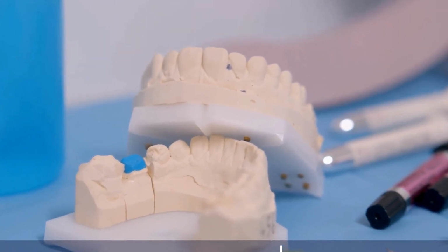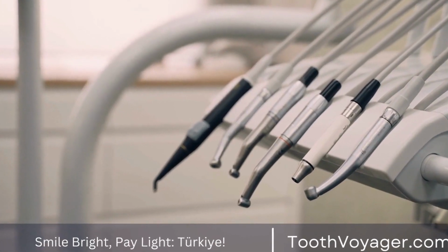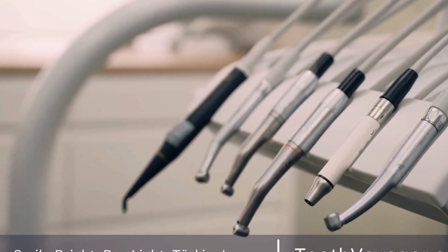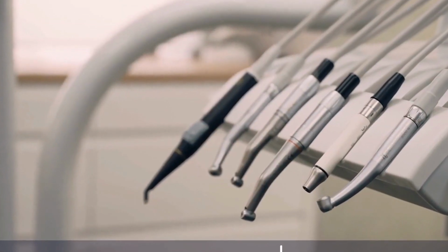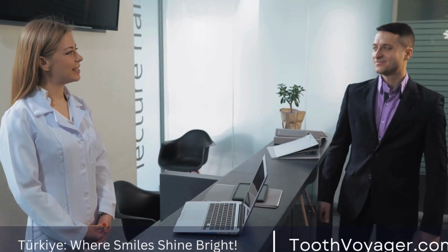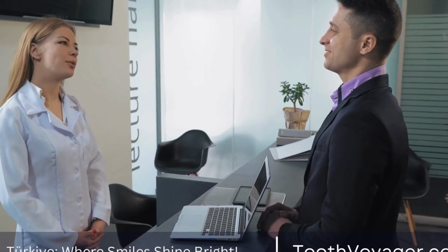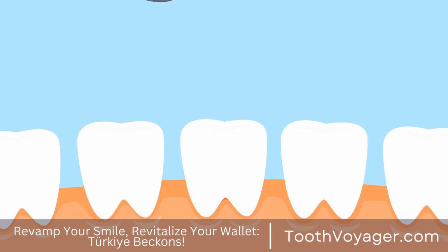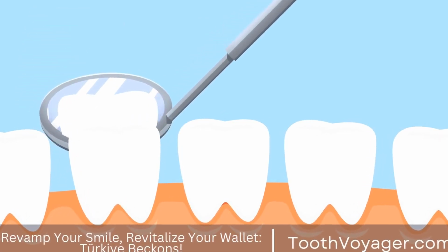During this time, the patient will need to follow post-operative care instructions to ensure proper healing and integration of the graft. After the bone graft has fully healed and integrated with the surrounding bone tissue, the patient may be ready to undergo the dental implant placement procedure. This typically involves surgically placing a titanium implant into the jawbone, which will serve as the anchor for the replacement tooth or teeth.